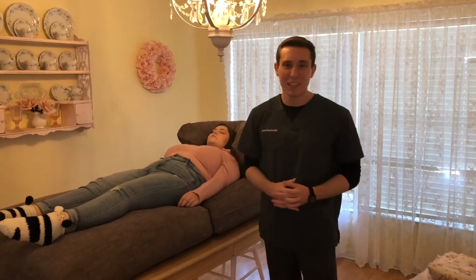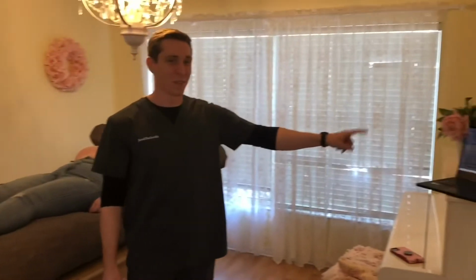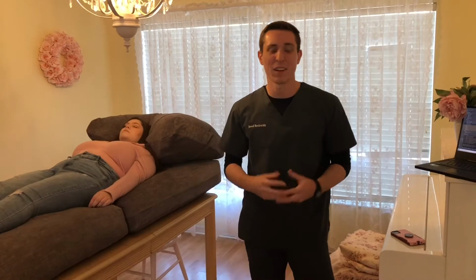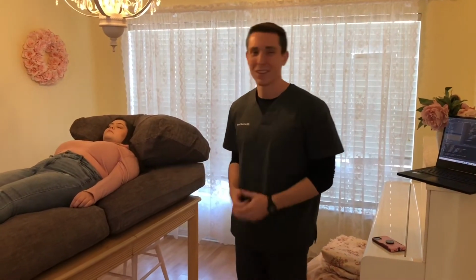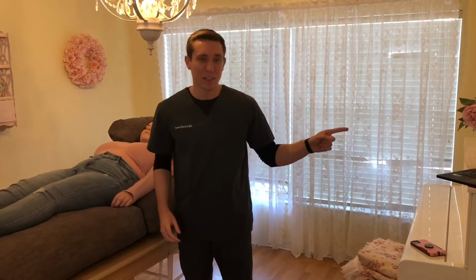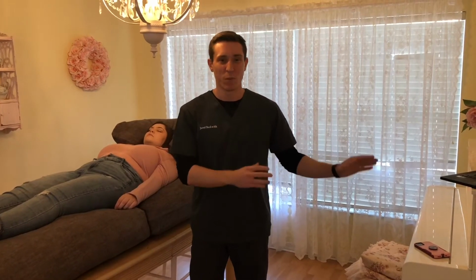So, the problem here is that if you're all by yourself and you're stimulating the patient's foot, let's say, and the EEG machine is over here, you can't be typing what you're doing and doing it at the same time. While these activations are pretty easy if you have 2 different people, if you're alone, it's close to impossible to efficiently do it. So my invention here allows an EEG technologist to stimulate the patient and talk to the computer as a voice assistant and have the computer make the annotations on the EEG for the doctor.